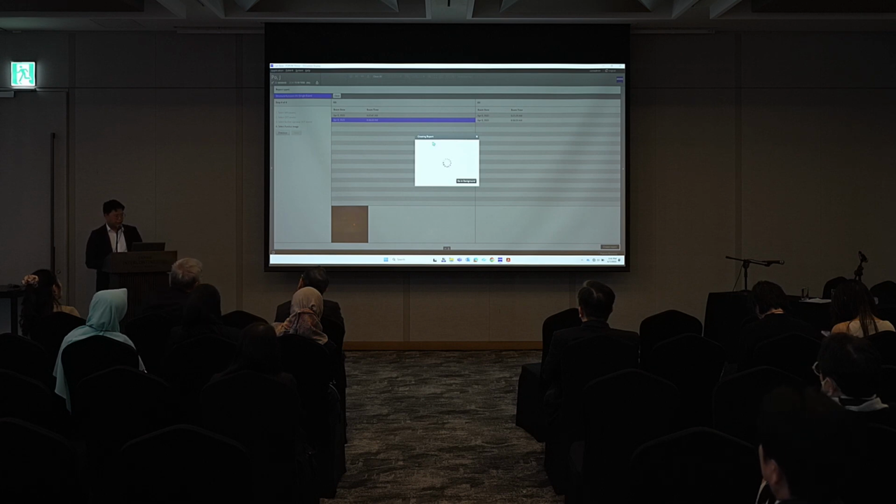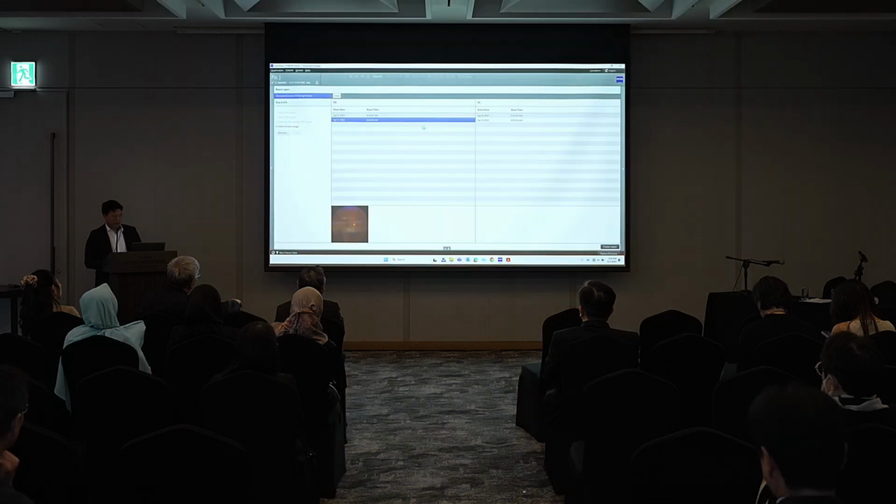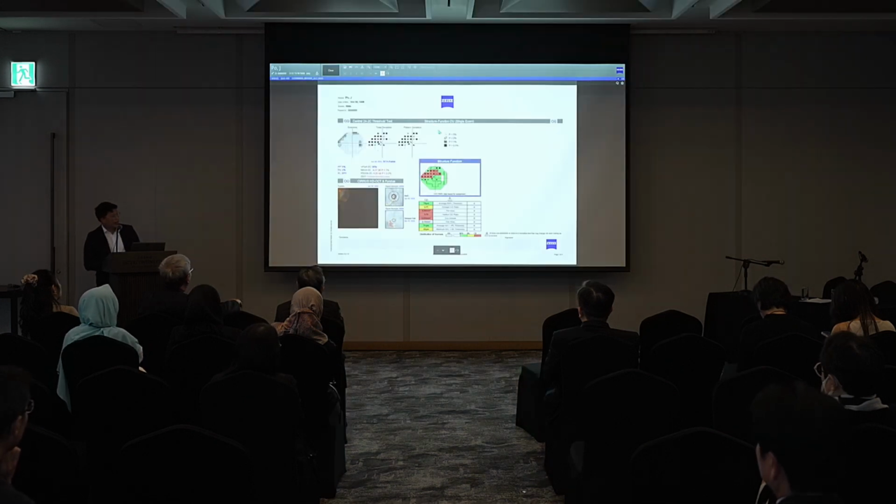And so basically this is what you've got to get your nurses to do, or whoever you want, or you can do it yourself if you have enough time in your busy glaucoma clinic. But here we're going to create our report. And here I'm just going to show you, we've only done it for the right eye, whereas we can do it for the left eye as well. But here's our structure function report that comes up.